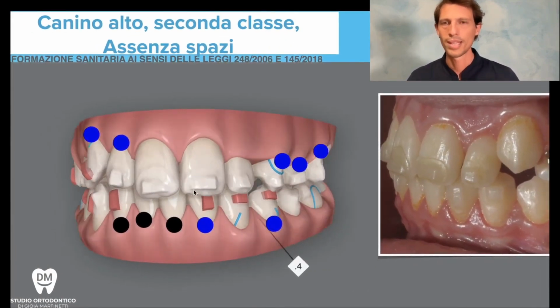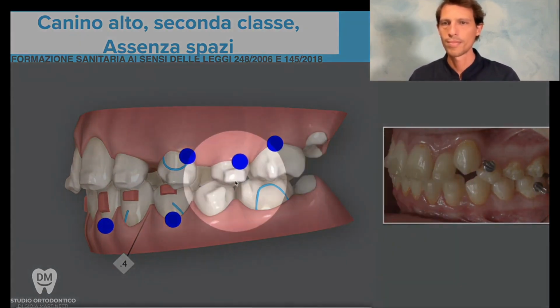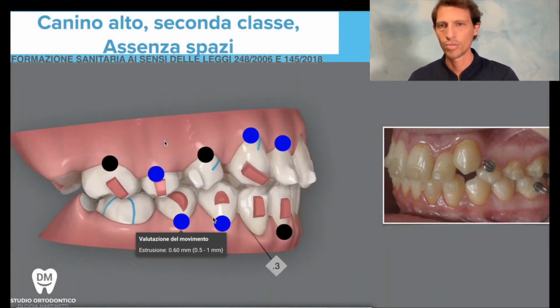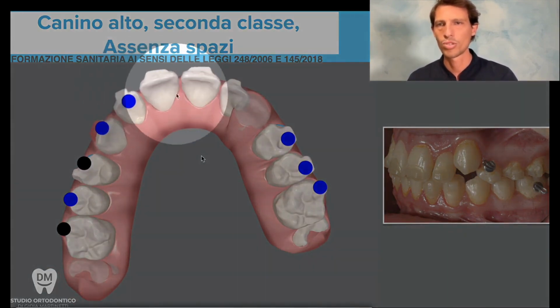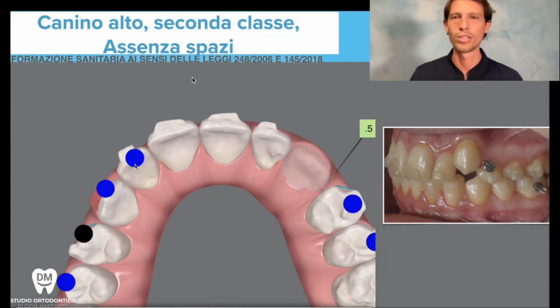So what we do is make these teeth move around a bit. You can see that the upper teeth need to move back until space opens up to allow this high buccal canine to come down on the left and also on the right. The teeth move back until there's enough space for the canine to come in. You can see that we need to shift the entire center. The upper jaw needs to be moved toward the patient's right to recenter it with her face.